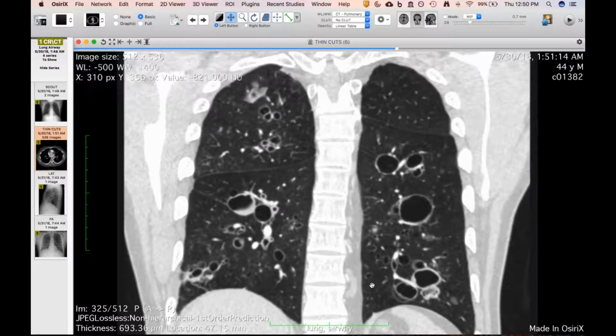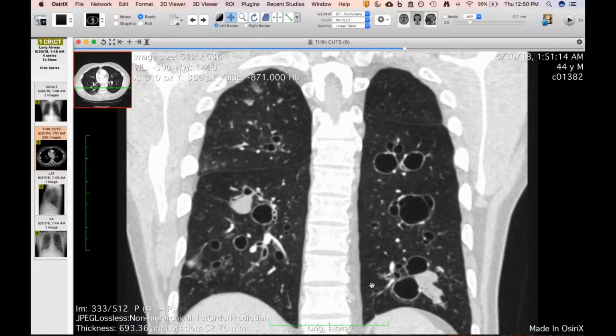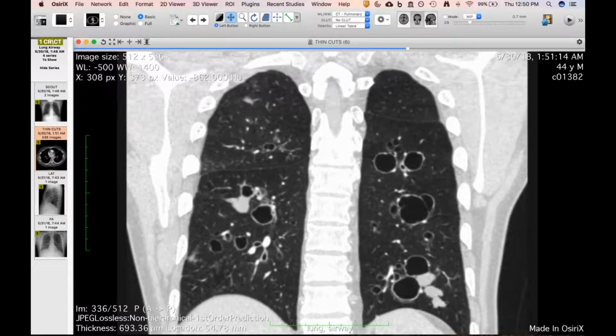I wonder if some of these are pneumatoceles that have arisen in a peribronchial location from a remote staph infection. The pneumatoceles in that situation usually come from little diverticula off the airway, so they're adjacent to airways. And the fact that these things are so sudden, we don't have airway dilation leading to them, suggests to me these could be that sort of condition of peribronchial pneumatoceles from remote staph. I'm not sure this is just bronchiectasis.